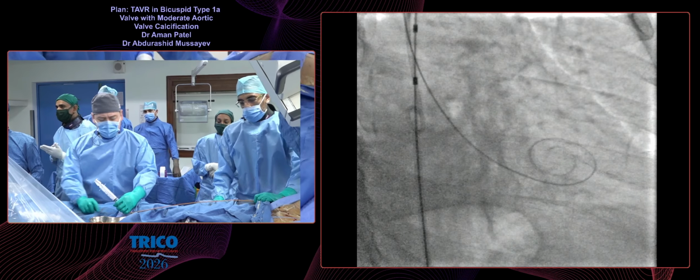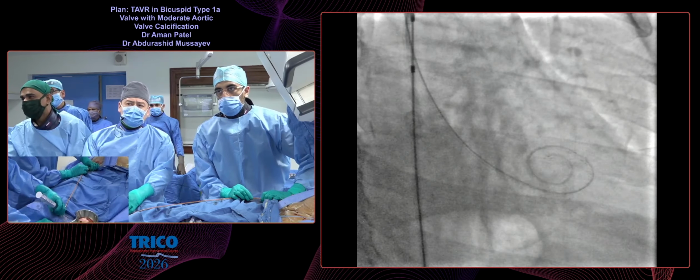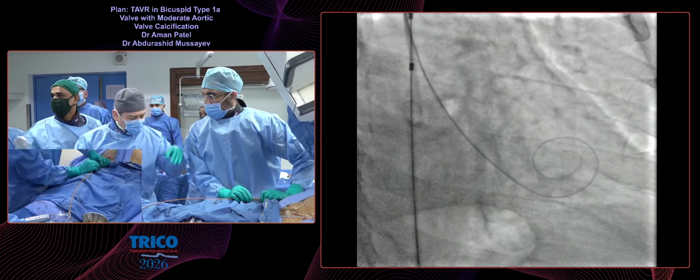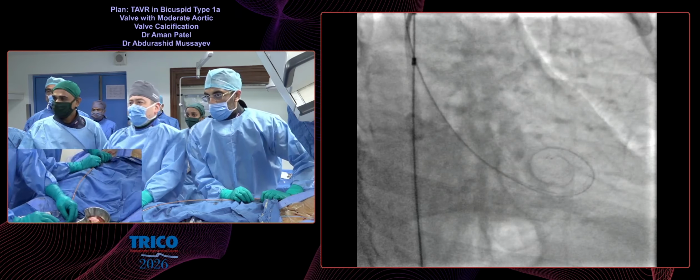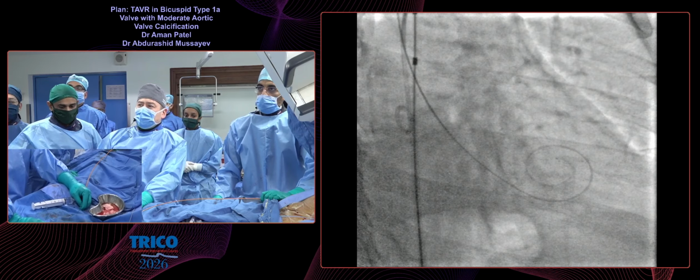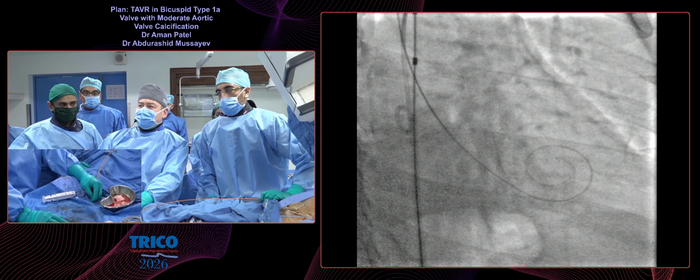Aman, Rashid, let me ask for your advice here. We have no experience with MyVal. You have experience of many different valves. Does MyVal cross as easily as the Sapien valve, or is it more difficult? I could answer these questions. It is very flexible if we compare it with the Edwards.